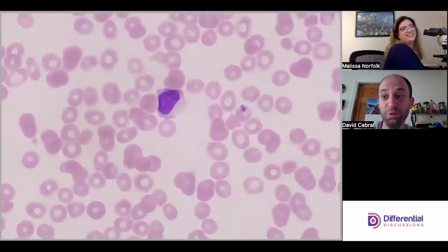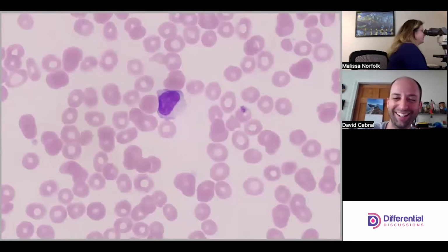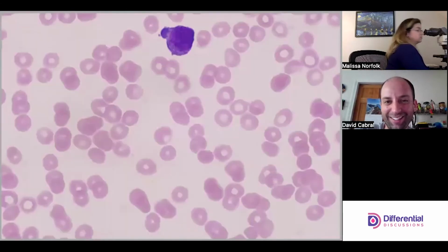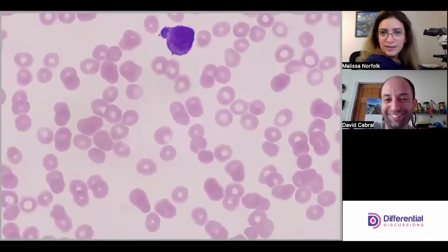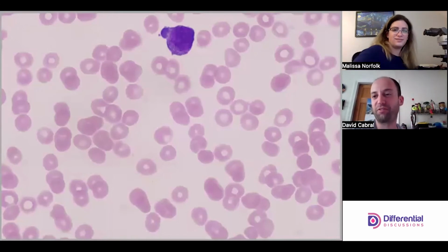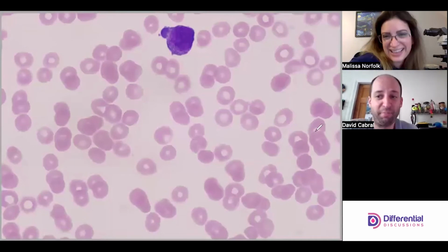Ooh. Hey, what's up, lymph? We get lymph. Ooh. So this would fit into that category of, I saw bad stuff already, so this guy's a bad guy.